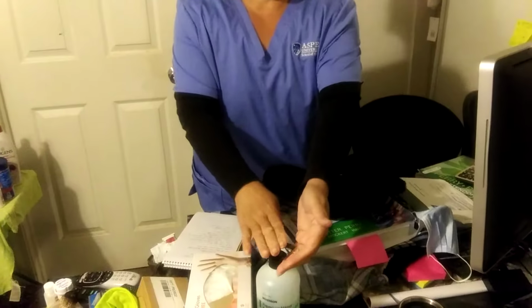First, I start by washing my hands, and I enter my room. I introduce myself. I'm Pauline. I'll be changing your dressing to your site. I use two identifiers to identify my patient. I compare it to what I have on my paperwork. I ask the patient his name, Frederick Jones. Okay, Frederick Jones, what is your date of birth? 9/10/24. So those are my two identifiers. Now I'm going to demonstrate doing the dressing change.